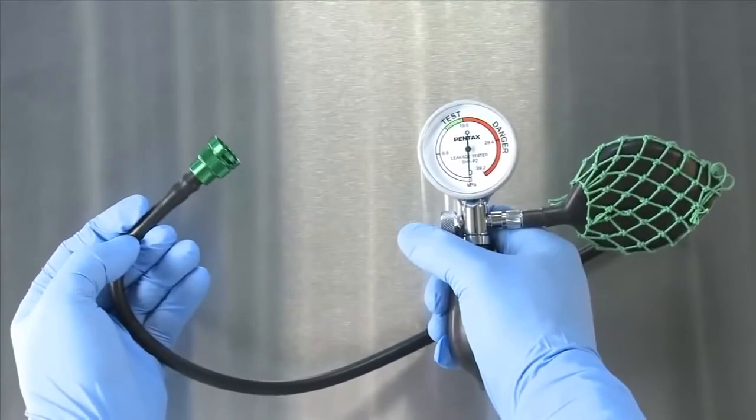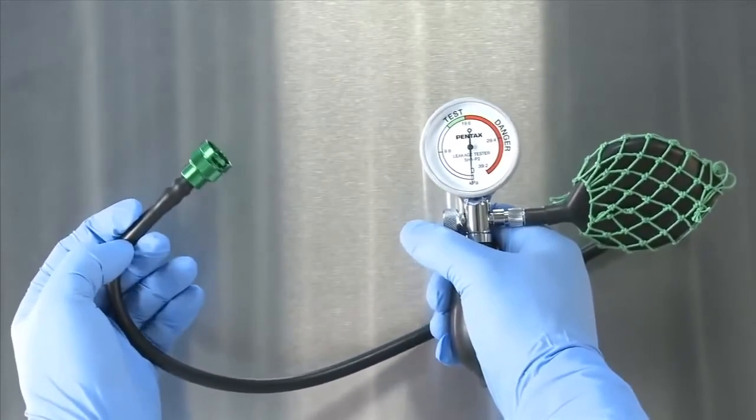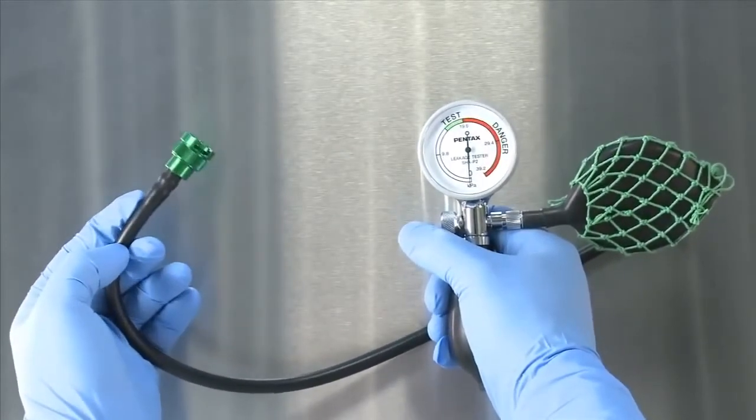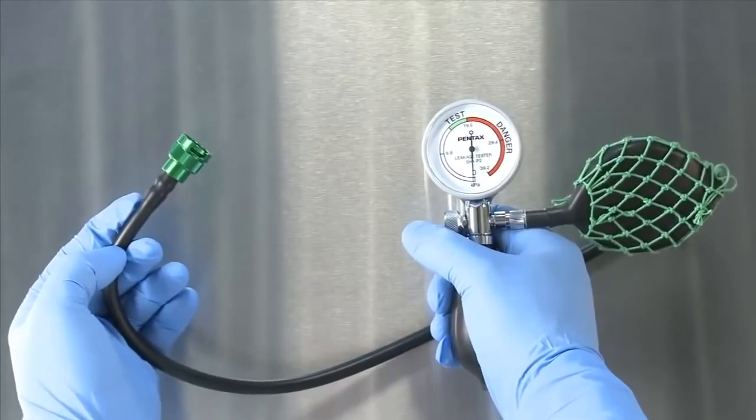If the needle stays in the green zone when pressure is released, the leakage tester may be damaged and another leakage tester should be used.